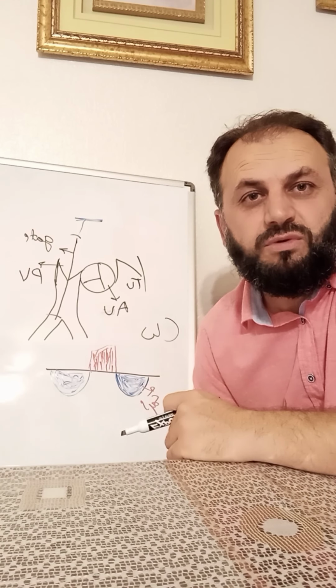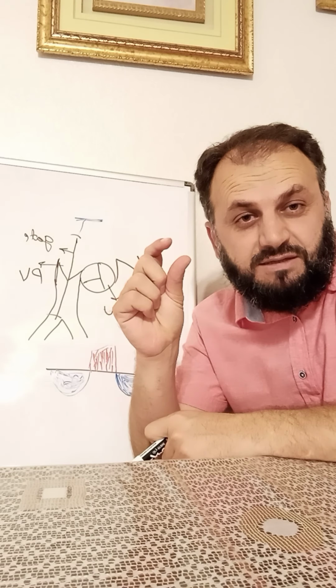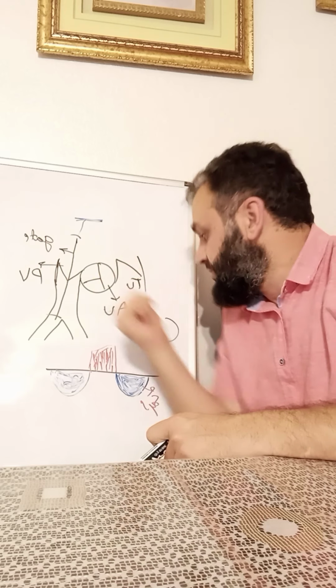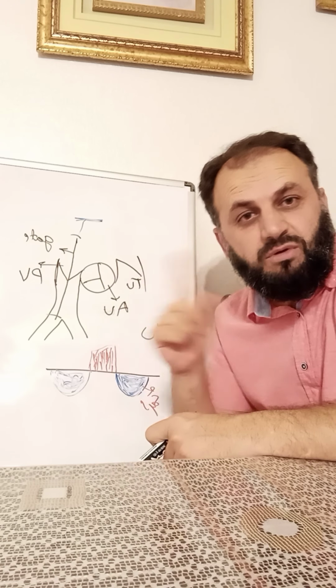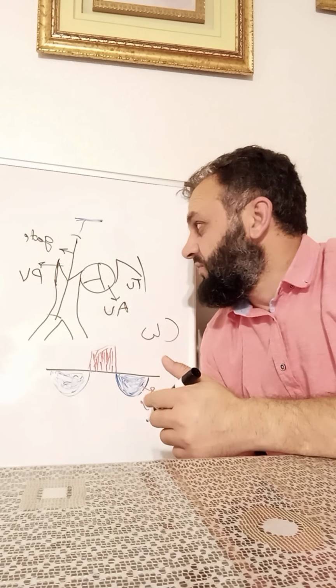I know all of you know these things, but I think that was a little important: where to put the gate size for pulse wave Doppler and how to use CW. For the CW, there is no gate size. The whole cursor is our gate. So hopefully that will help you guys.